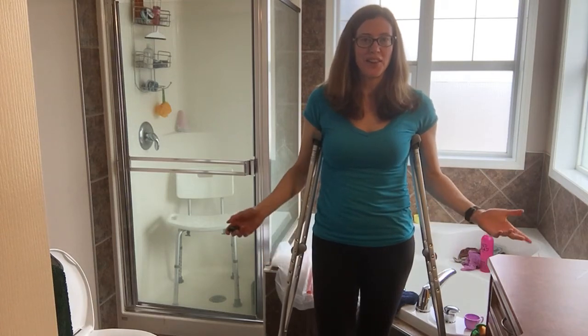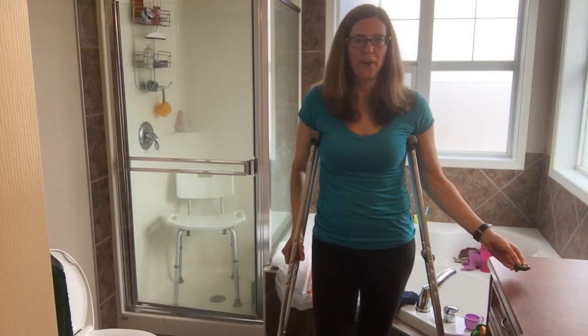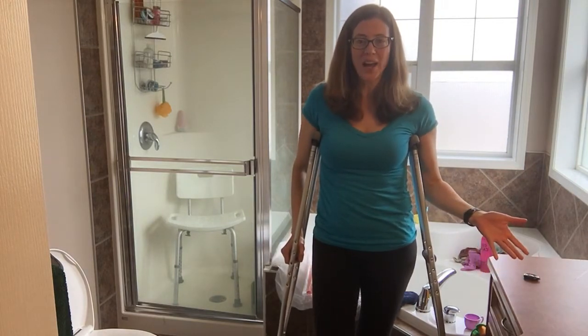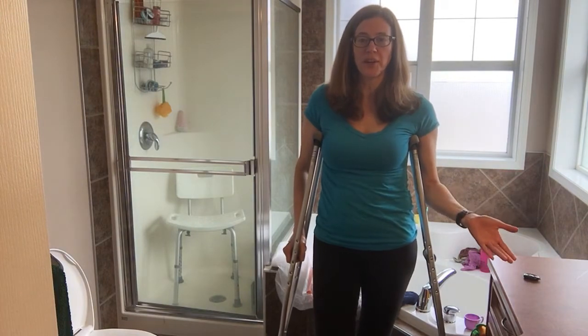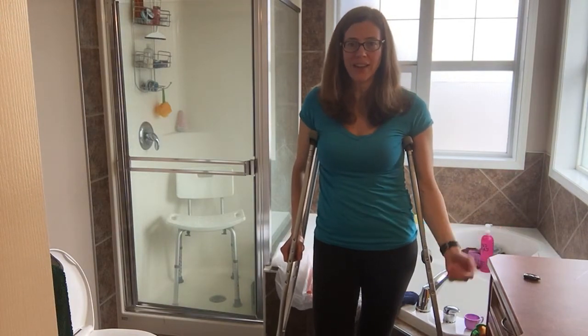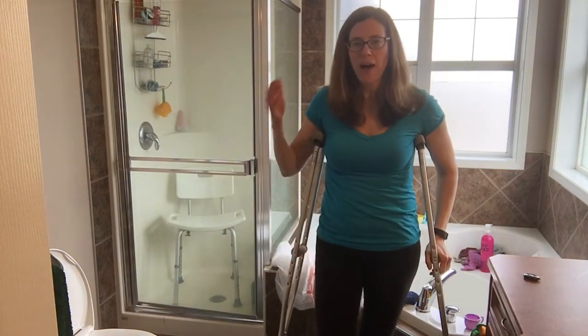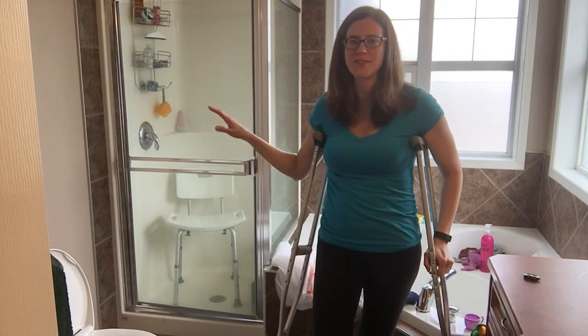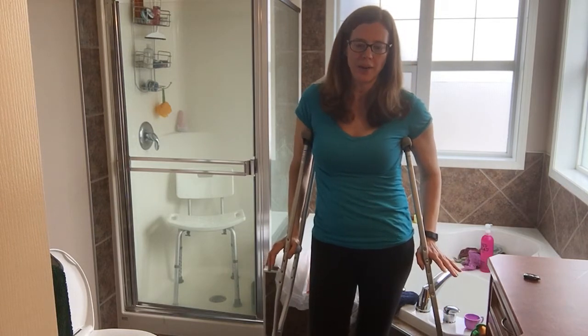Hey, it's Robin. I've been having a lot of people interested in how I use crutches, so I thought I'd just give a little demonstration of how I'm currently showering. If you have a therapist you're working with, they can give you advice on how to get in a shower or bathtub — it's going to vary according to your individual circumstances and your setup — but I just wanted to show you what I'm doing right now.